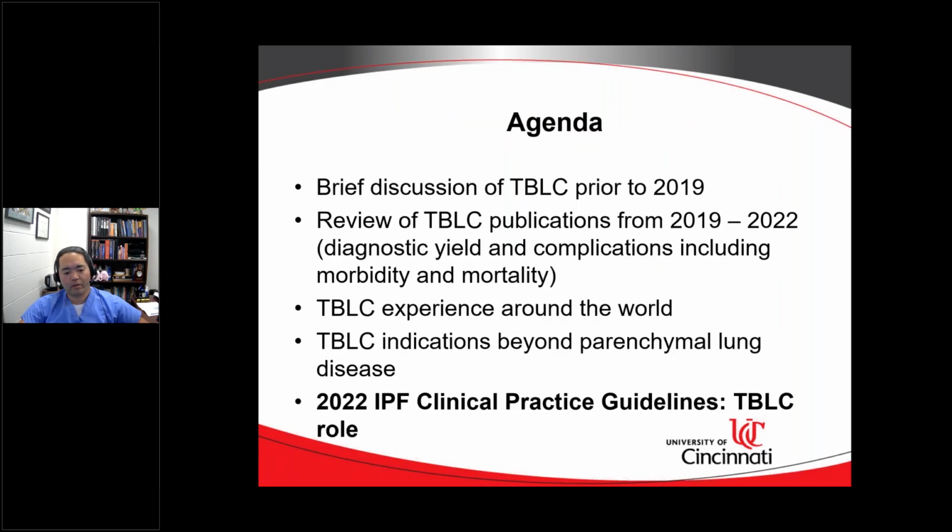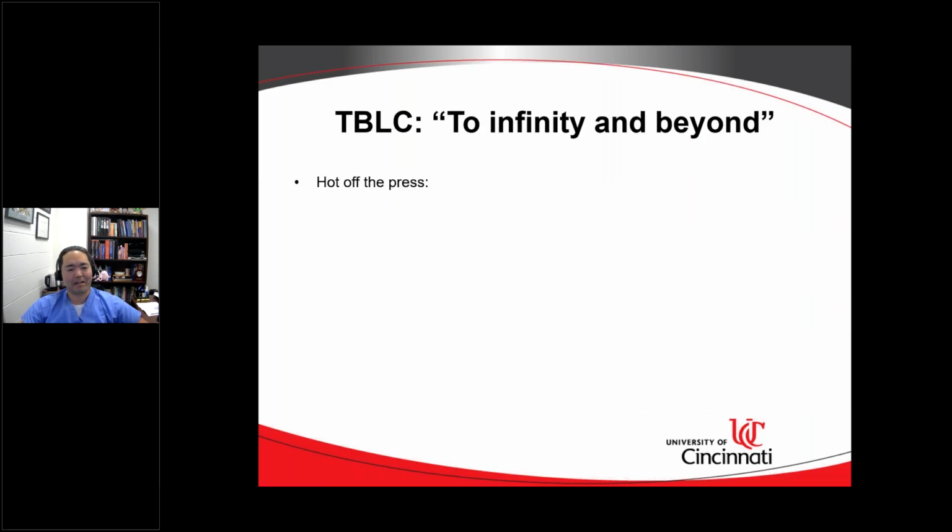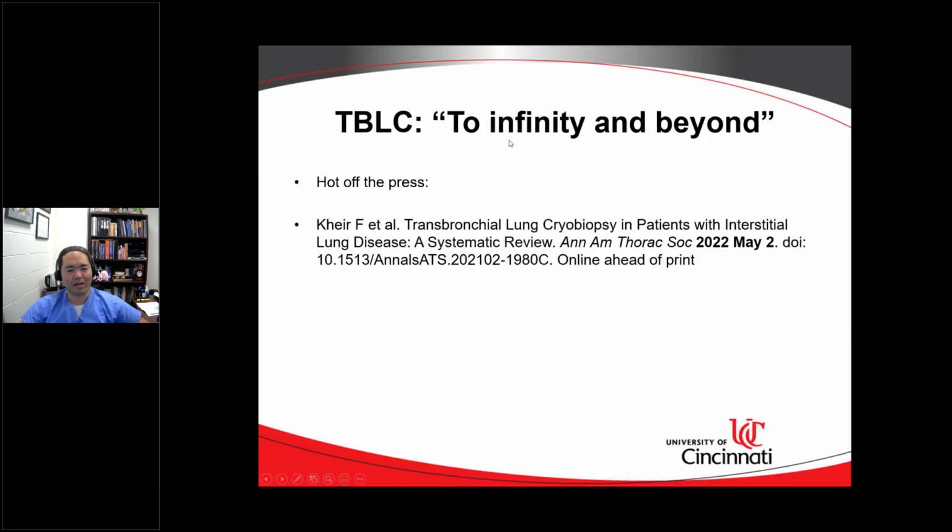Okay, so then fast forward to 2022, May the 1st, when I was about to start making my presentation, and hot off the press. That's why I just stayed in here, and we can talk about it. But I think right now we're not at the era in which we're questioning whether cryobiopsy is feasible or not, if it's safe or not. I think right now it's to infinity and beyond. It's actually, well, not comparable, but has moderate concordance with surgical lung biopsy.